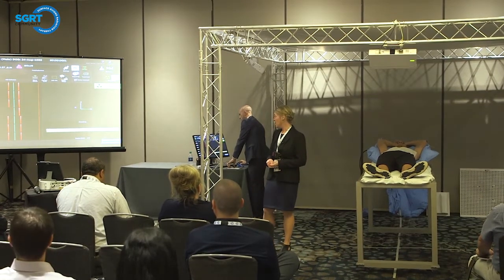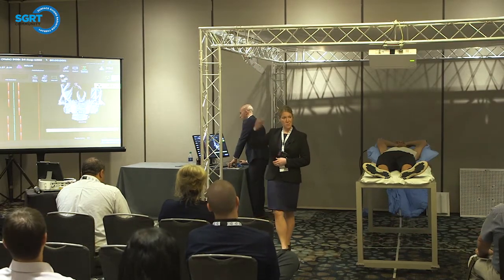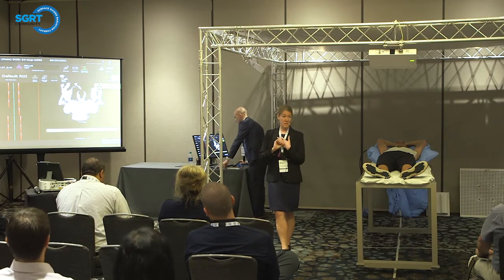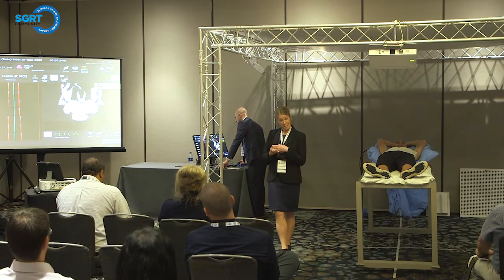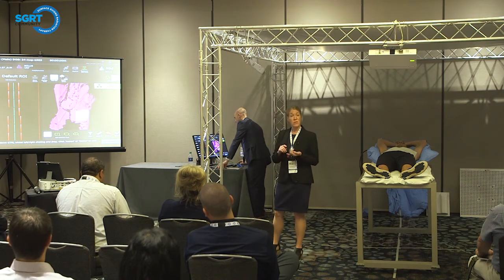All right, so once the bolus is placed, we're going to go to capture, and we're going to capture a new reference. And if you notice right now on the right side, there's no image there. So this is day 1. There's not going to be any bolus image from SIM, so it's blank. So at this point, on day 1 only, we do need to add an ROI.